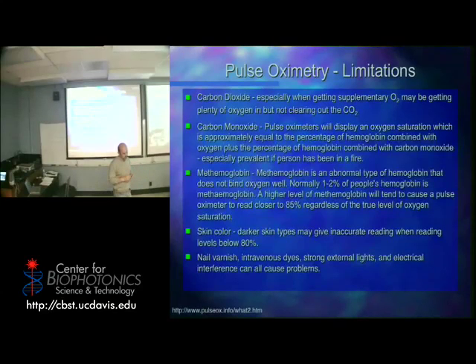Well, if you're running out of breath, doesn't your body say that you just need more oxygen, not that there's no oxygen there? So you're asking how the body itself responds physiologically? Well, I think the body looks at the CO2 concentration. So why wouldn't we create a device that measures CO2? Ideally, you'd want to measure both, right?